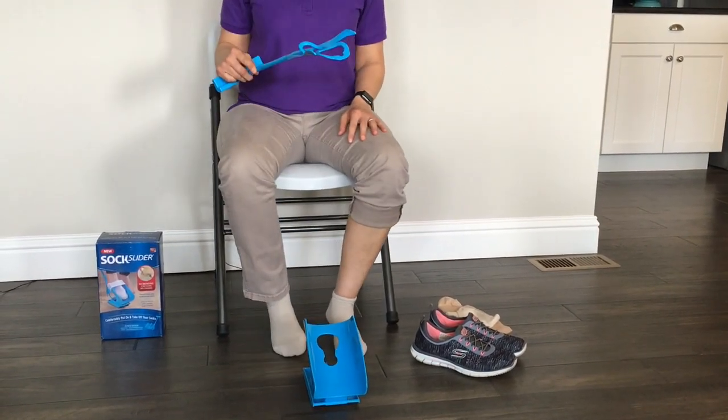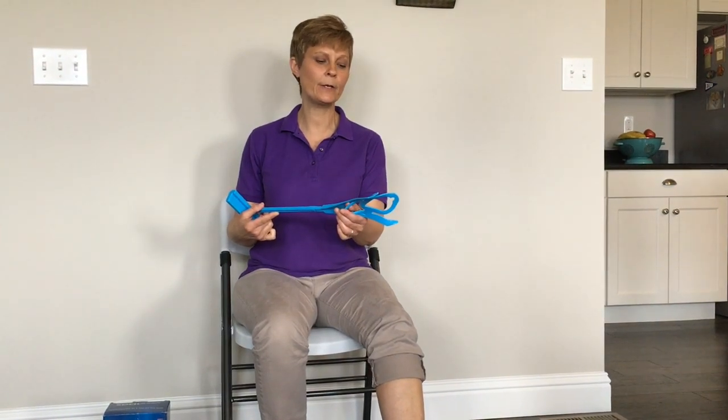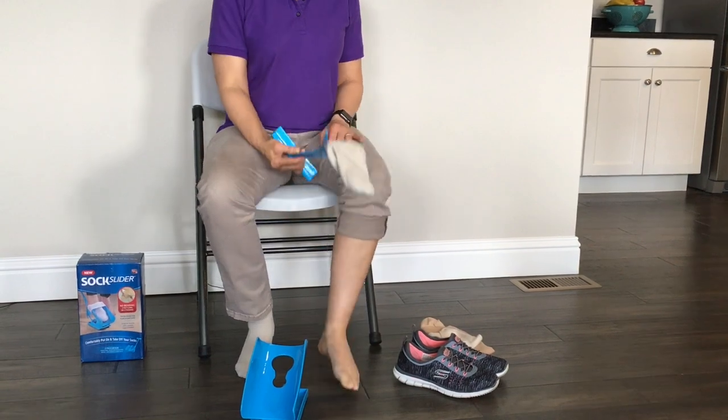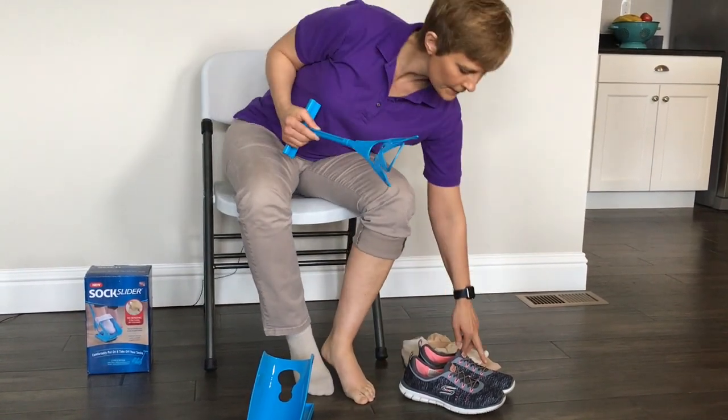Now we're going to try a dress sock, but while I'm addressing this, I want to show you that they also said you can use this piece right here to help remove one of your socks, which is true. You can take this little piece, slide it in the back of your sock, and push the sock off just like that. So that works. Let me get a dress sock now.